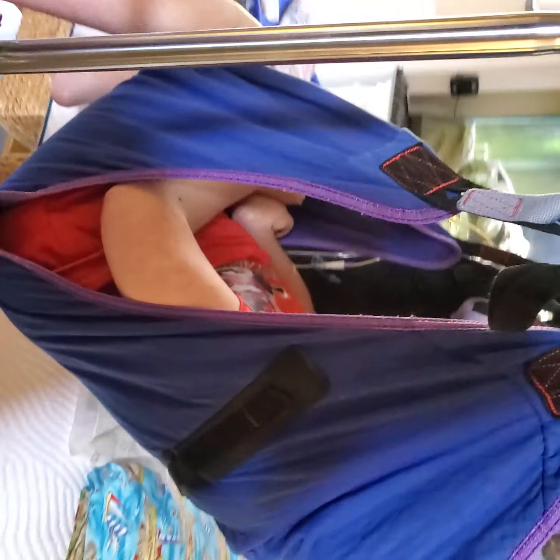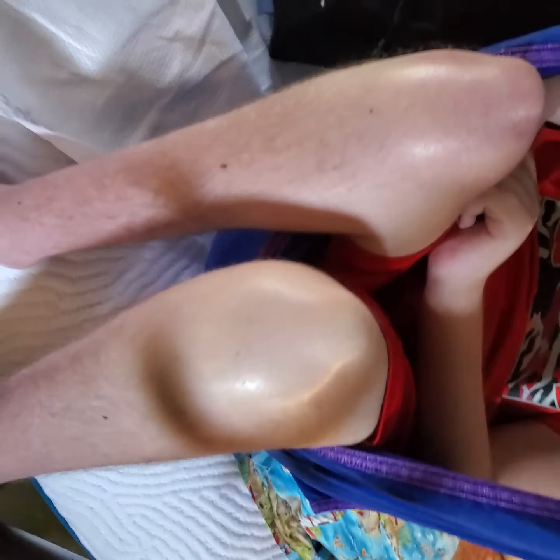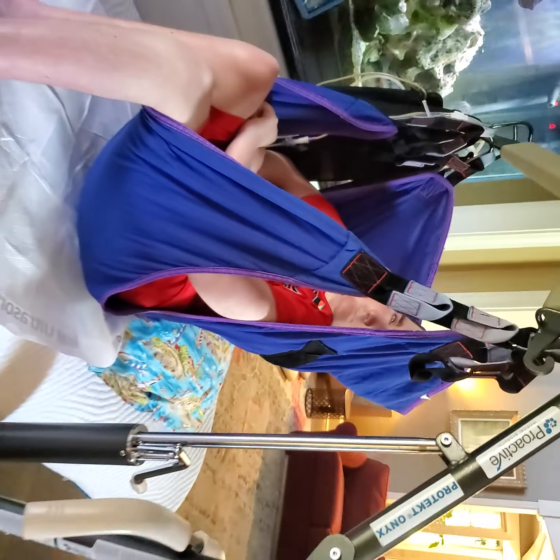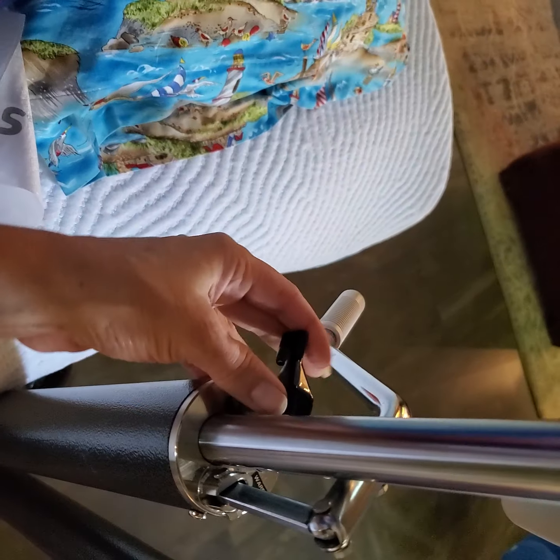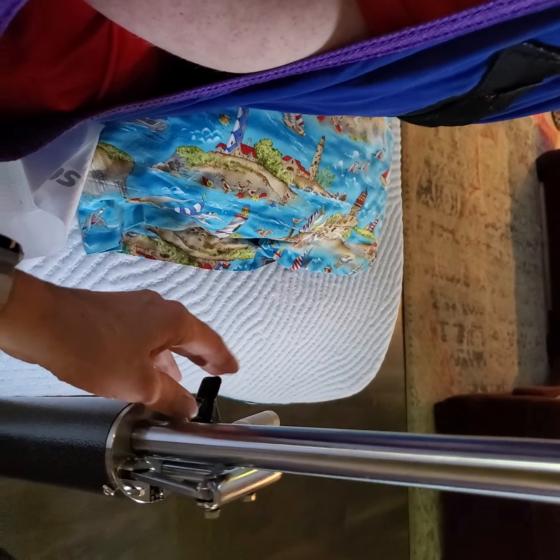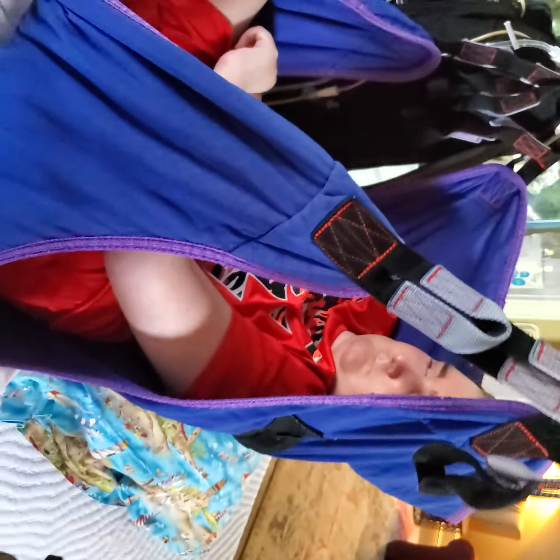Now this is a little tricky because technically you can see his bum's a little lower than the mattress, so you're going to have to lift his bum up a little bit and scoot him onto the mattress while you're pushing the lift in. And I'm going to set this down for that. So now we have Jack aligned, and what we're going to do is lower the lift. How you're going to do that is take this lever and bring it in. You don't have to bring it in very much, and it'll slowly bring him down. Sometimes it'll move because the weight is shifting.